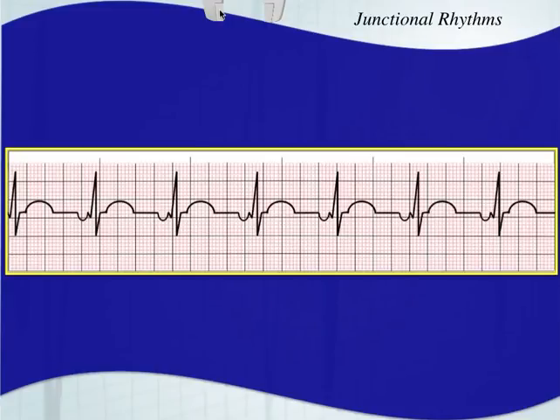Here's a different example. We have an inverted P wave, a short PR interval, one P wave for every QRS complex, a very regular rhythm, and a narrow QRS complex. Counting the rate — seven complexes gives us about 70 beats per minute. So this is an accelerated junctional rhythm because it meets the 60 to 100 mark.